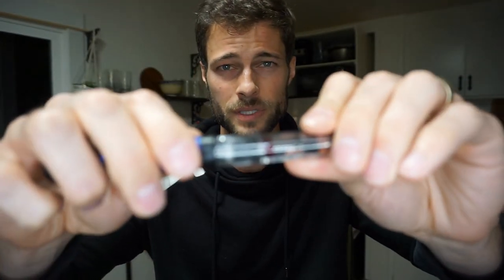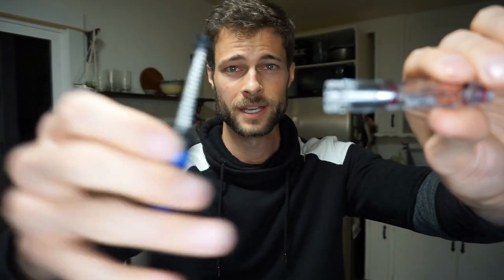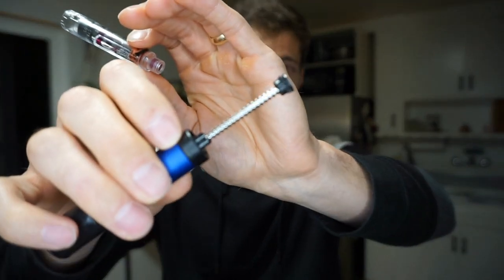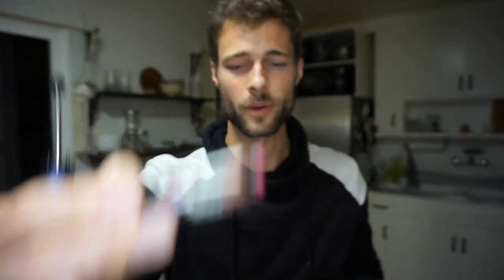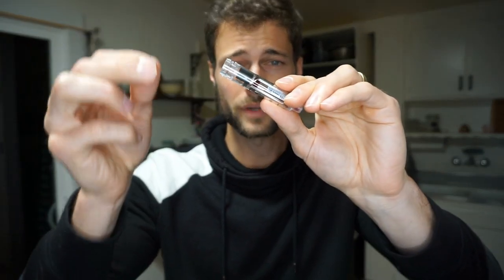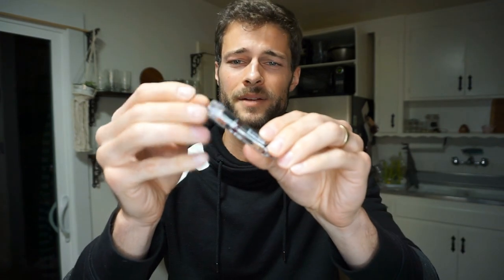First step: twist the plastic piece here — get that to focus — there you go, it slides right off. Now we have this little spring and the empty insulin cartridge. Set that aside. This is where the new insulin cartridge goes. Before I put it in, we're gonna inspect it — make sure it doesn't have any cracks. It looks fine. Make sure it's not expired — this expires in five months, so we're good. Slide it in there, good to go.